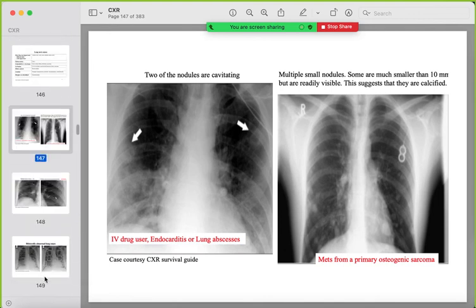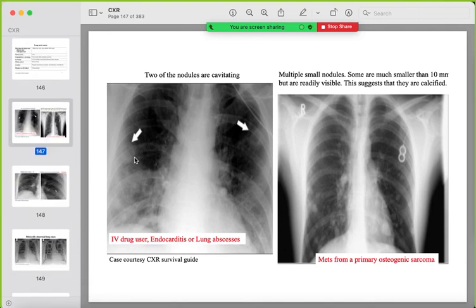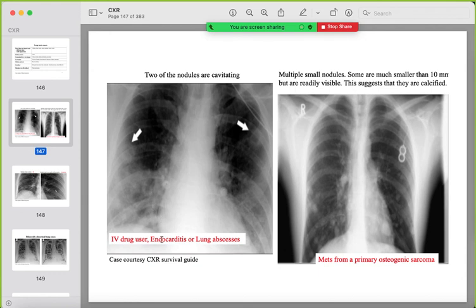Examples of multiple pulmonary lesions: multiple nodules with some cavitation in a patient who is an IV drug user or has valve disease with endocarditis → suspect multiple septic emboli/abscesses. Dense calcified nodules even when very small → primary osteogenic sarcoma metastases. Miliary nodules from TB — innumerable and very small in size. Calcified miliary nodules → previous chickenpox/varicella pneumonia.